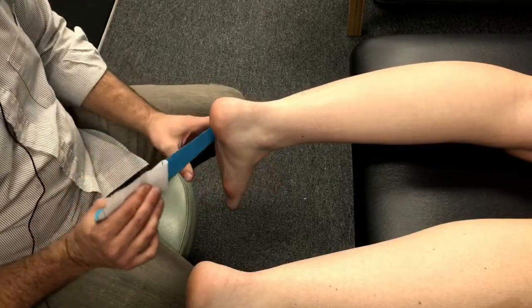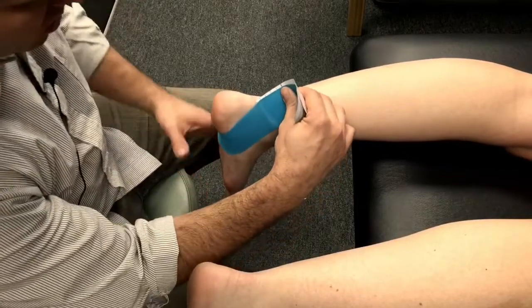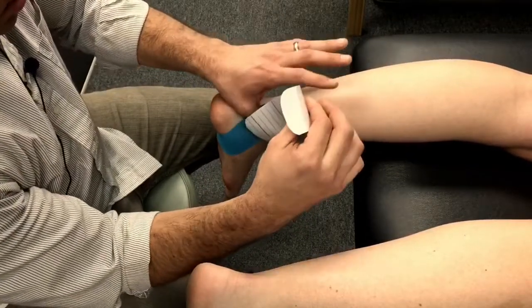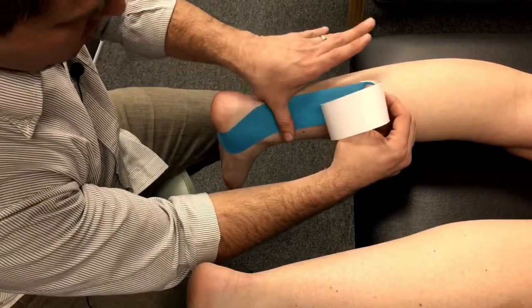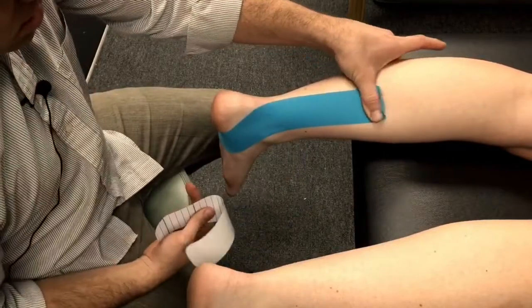We're going to put some tension on it and follow the path of where the posterior tib would be going. Notice we're going to put a little more tension on this tape than we would if we were addressing swelling. Let's make sure it's stuck down pretty good at the end — we don't want any tension there.